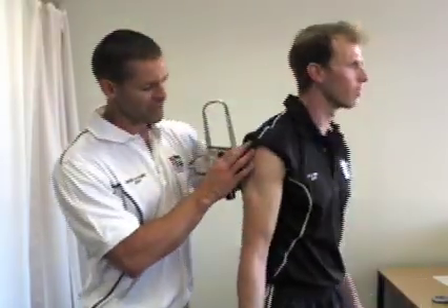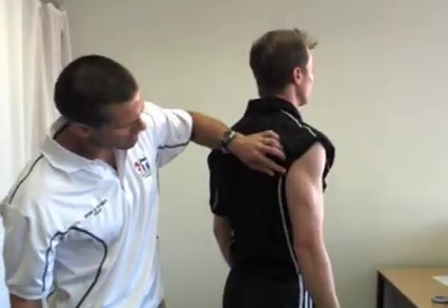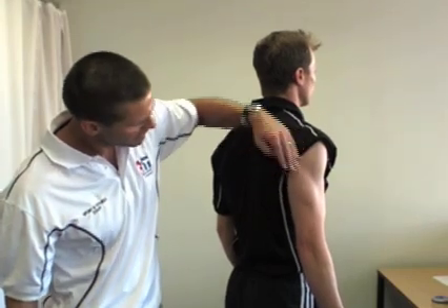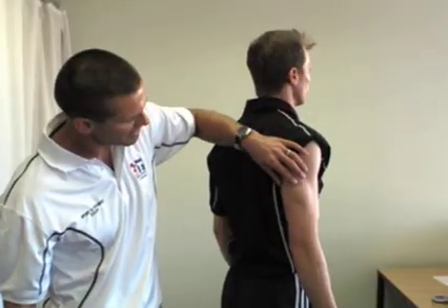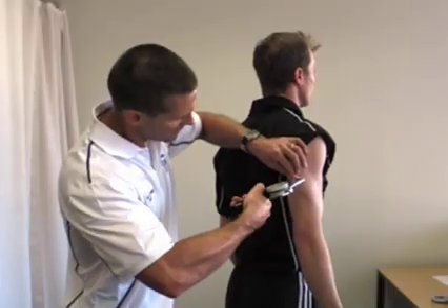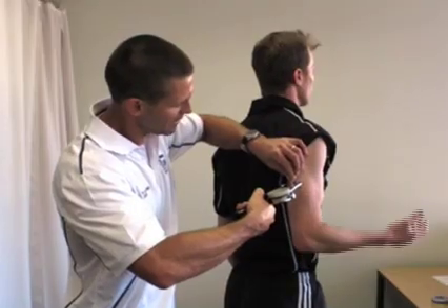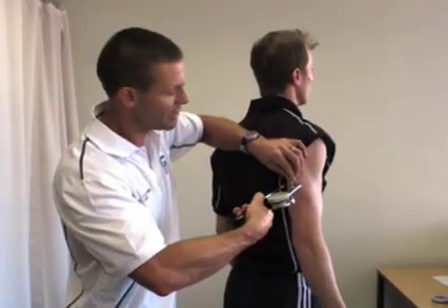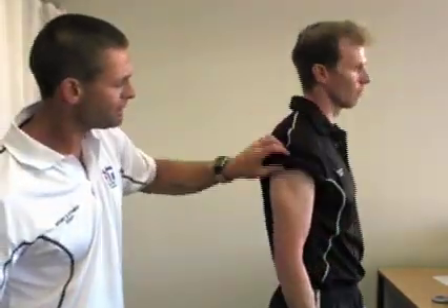For the tricep, if we turn Simon around, we can see definition in his tricep and we've got the cross right in the middle of where we want to take the skinfold. Same deal — we're taking it parallel to the tricep and also parallel to the humerus. We grab the skinfold right on the cross, put the calipers on, ask Simon to do a quick halfway bicep curl and back down, then take the measure which is 5.2mm. Take it off and give it a rub.